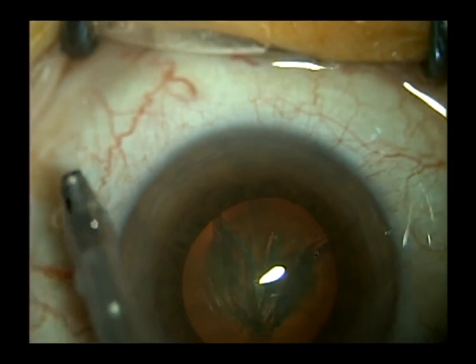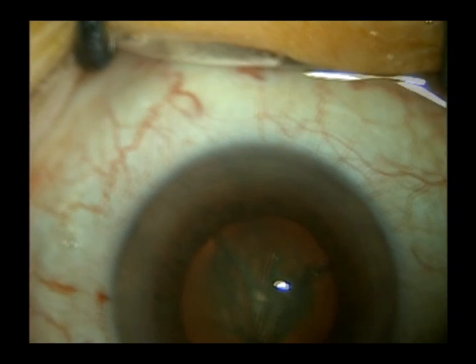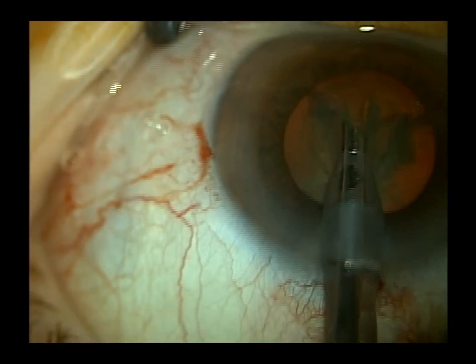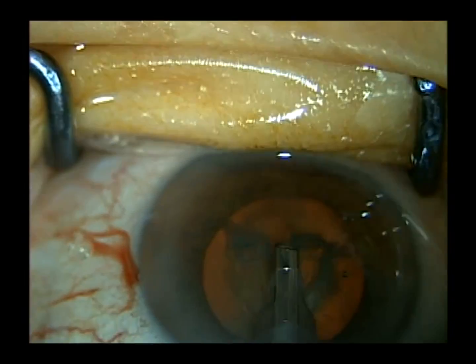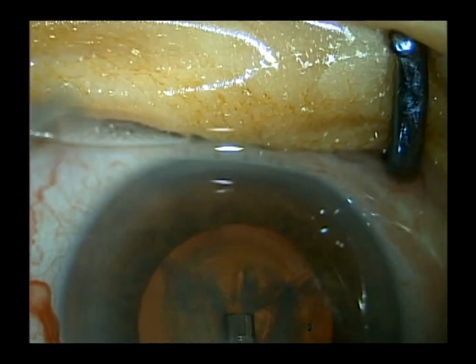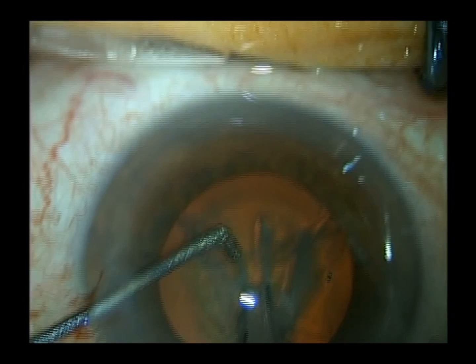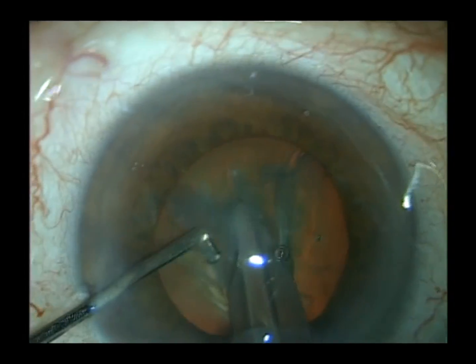Then we introduce our AMO Signature phaco piece. I make sure I move my sleeve toward the handle to expose just the right amount of the phaco tip. I usually use bevel up. I get rid of my air bubbles. Then I create a central groove. I'll use my second instrument, which is a blunt chopping instrument, to crack, manipulate, and chop the cataract. Sprinkle a little more topical anesthetic on the eye just to make sure that patient's comfortable, and then we go.